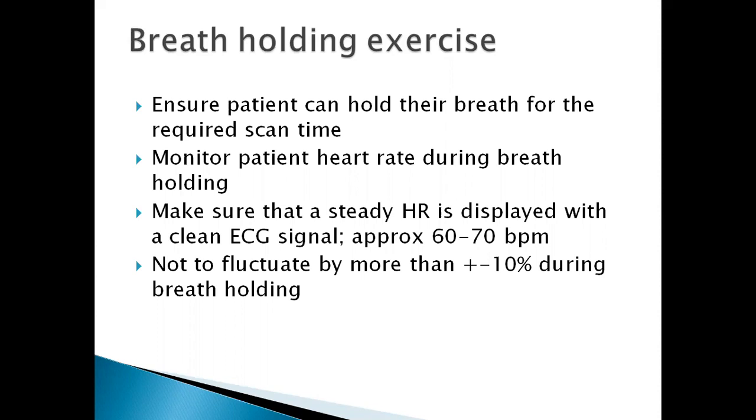I'll just cancel the examination and refer them for another modality. However, sometimes when you just administer the beta blockers and you wait a bit, usually the heart rate does come down. Also talking to the patient, making sure that the patient is calm even before you start calling the doctor, helps.